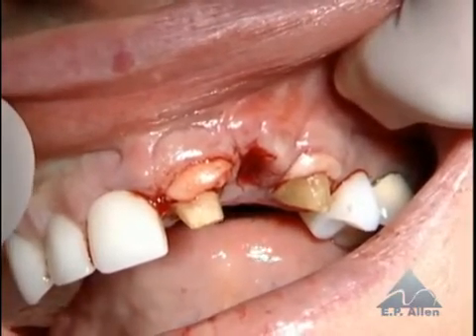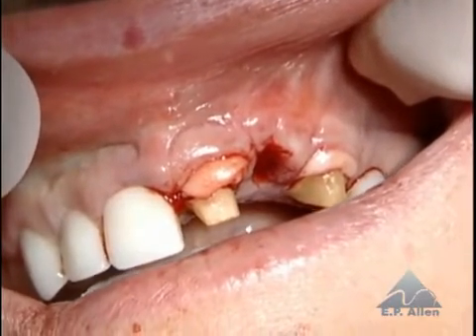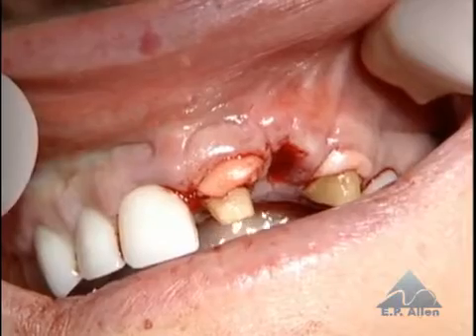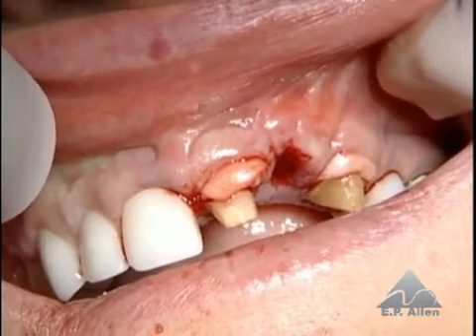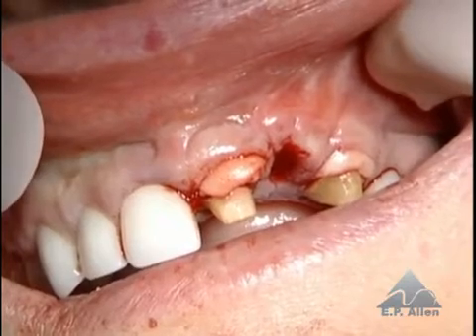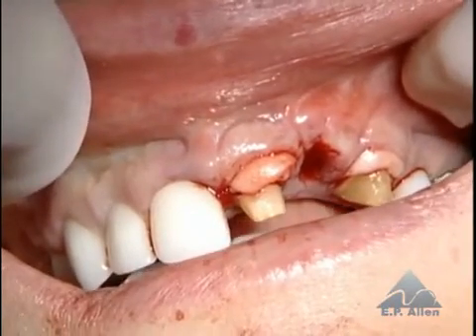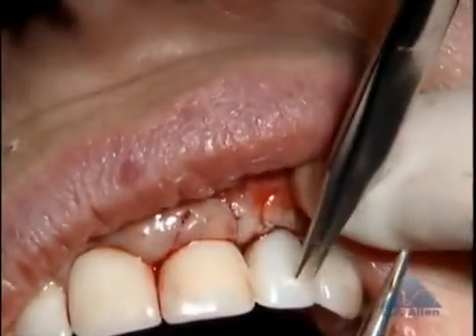And we have a choice of placing the provisional back on and suturing around it, which has the advantage of stabilizing the graft at the desired position and also elevating the papillae to the desired position and seeing it. But it has the disadvantage of difficulty in finding the graft in the pontic region. So I'm going to choose to suture first, and we certainly have the option that if we don't like the way it's going, to discontinue and place the provisional and do the suturing after placing the provisional. It's just advantages and disadvantages either way, and you have to decide which ones take priority. So we'll start with a suture.